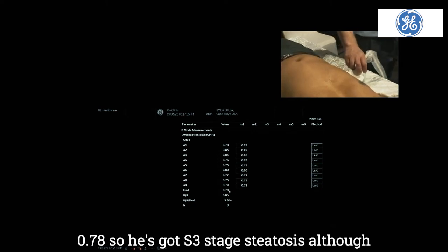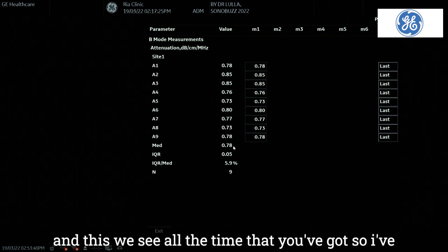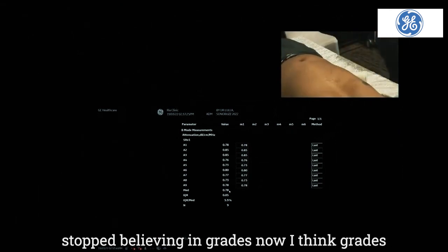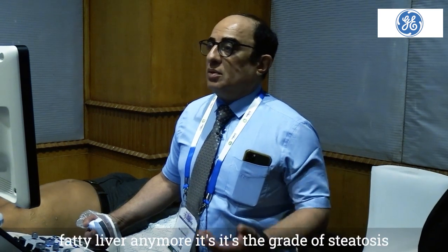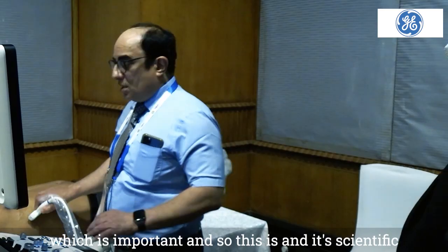So he's got S3 stage steatosis, although the ultrasound is showing grade 2 fatty liver. And this we see all the time. So I've stopped believing in grades now. I think grades were not really the way we should be doing fatty liver anymore. It's the grade of steatosis which is important.